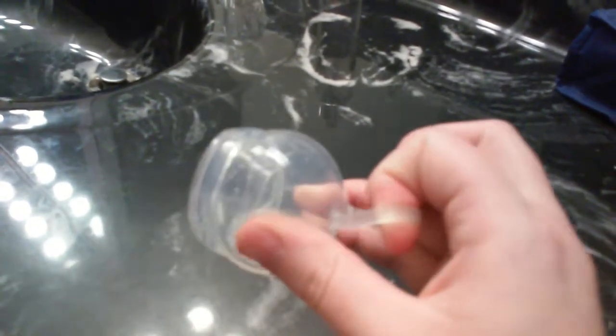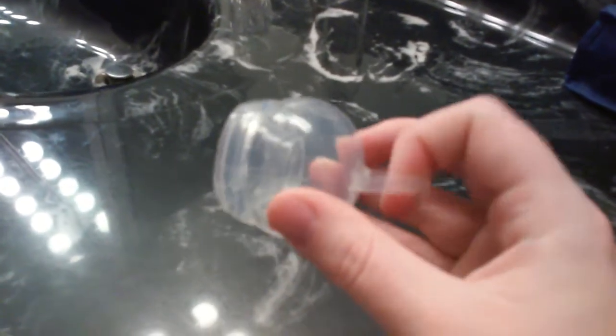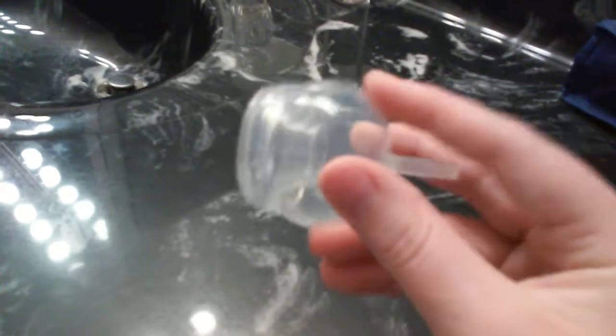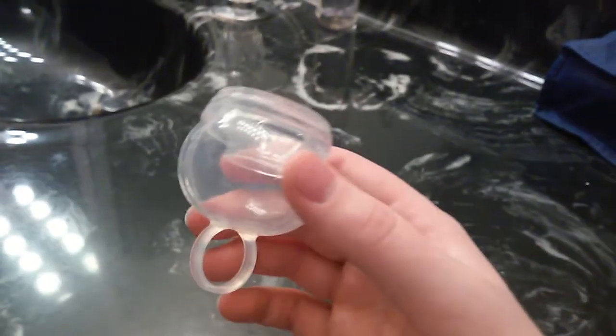It has an interesting removal ring as it has this hoop to remove it. But don't try to use this hoop just on its own to remove it. You still have to slide your finger up, break the suction, and then you can use the hoop to remove it. Otherwise you're going to cause yourself a lot of pain.